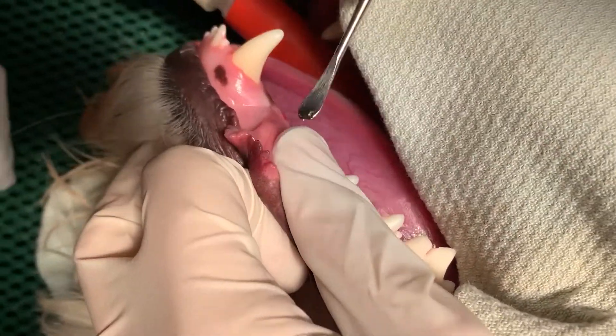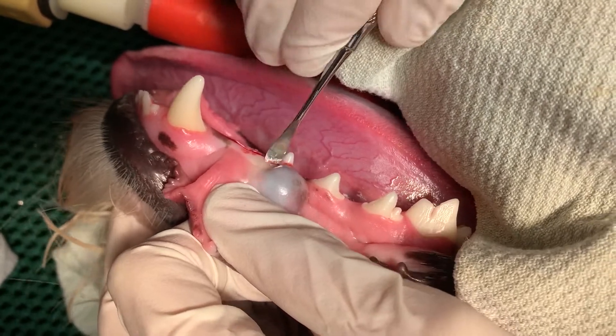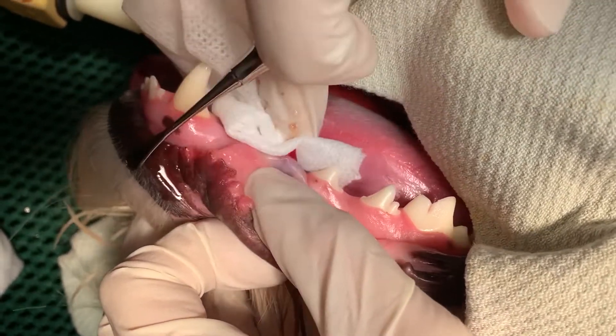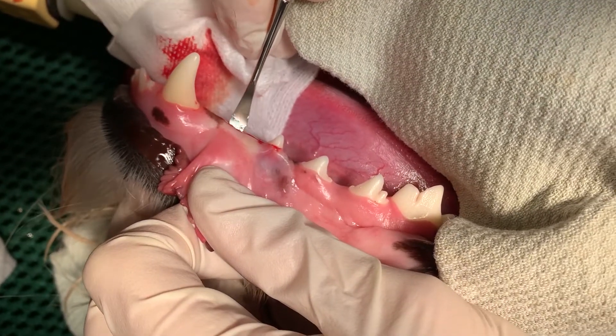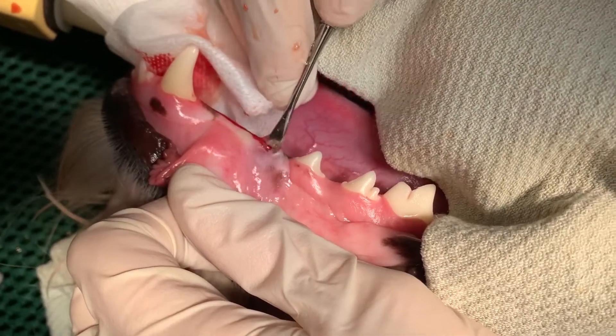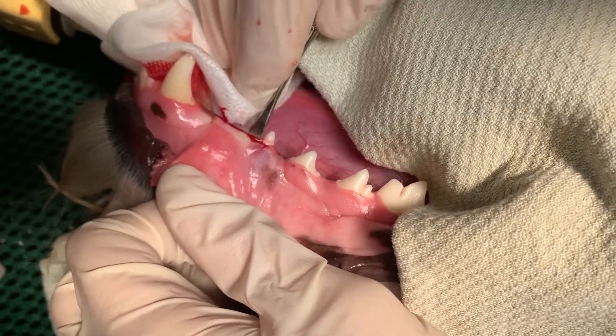We're going to basically open up the gingiva over top of this lesion. You can see there that cystic fluid is expressing out. We're going to use the periosteal elevator and pull the gingiva down so that we can expose all of that area and get to the cyst itself, and then also remove the tooth, which is actually what the problem is.